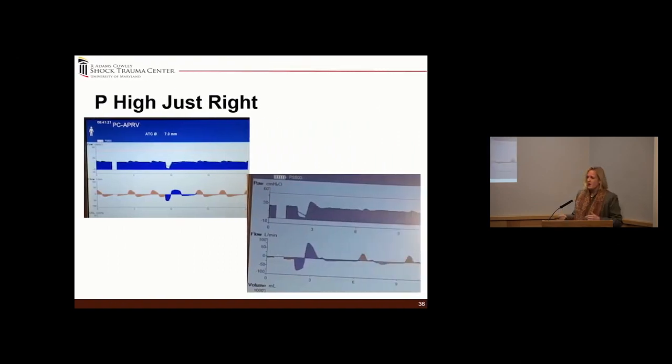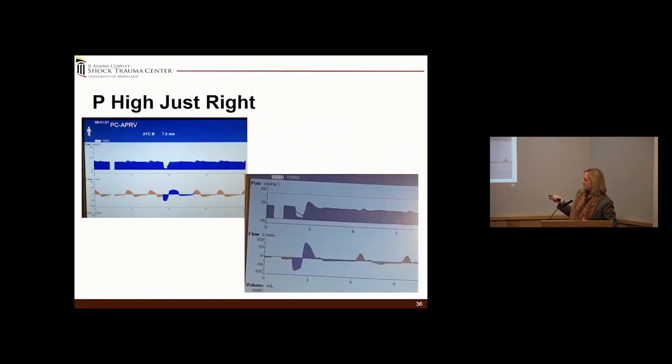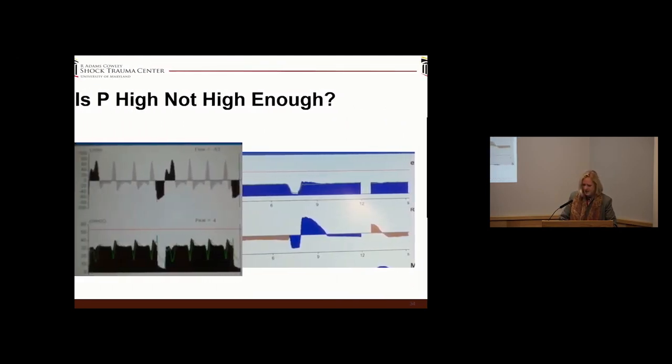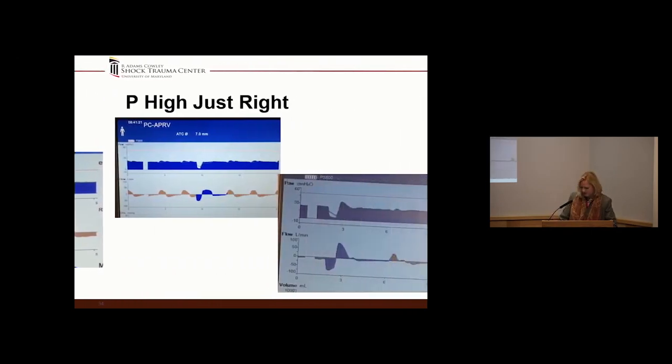So is it just right? And the 3 bears here. So this is actually a spontaneous breath and then a natural passive exhalation, and you can see that here. And there's really no change in the airway pressure. Sorry, I want to go back here because I do want to show you this. And this is the difference.